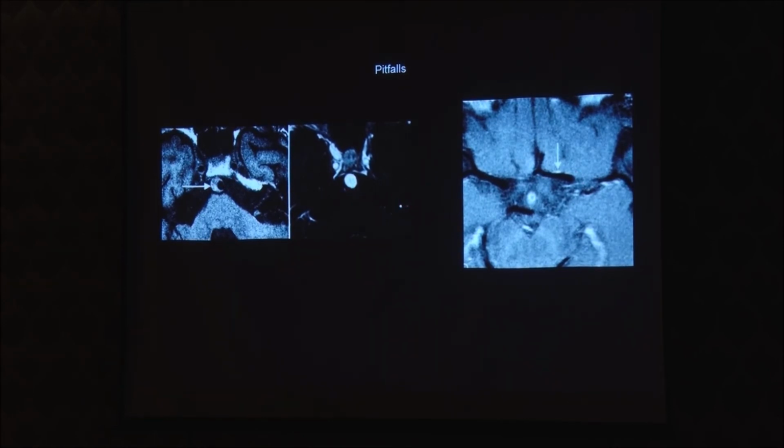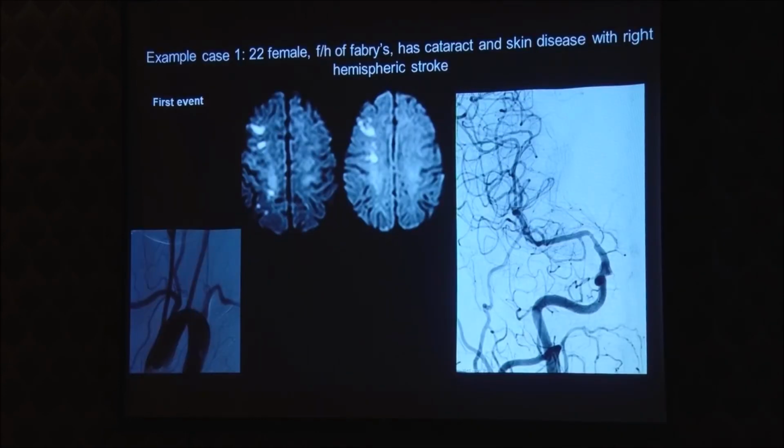And sometimes with venous contamination, there can be some venous enhancement along with the wall, and that can be considered as enhancement. So going through some cases. Now that we have discussed 5 etiologies, we'll just have some examples.